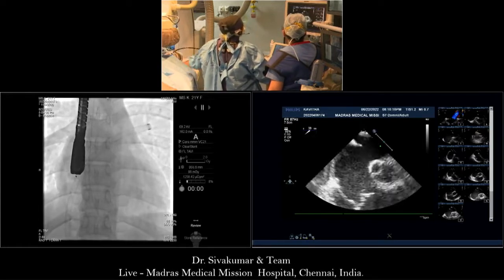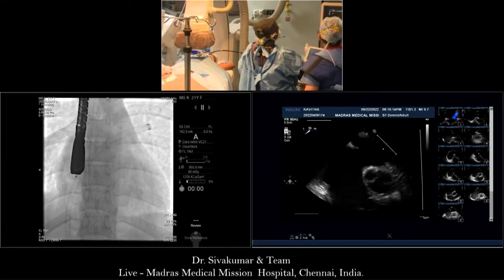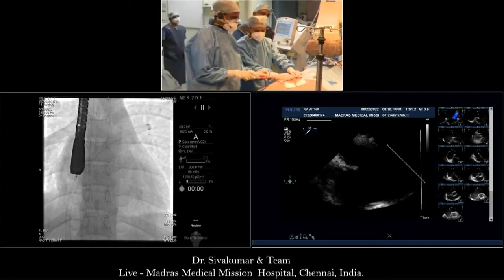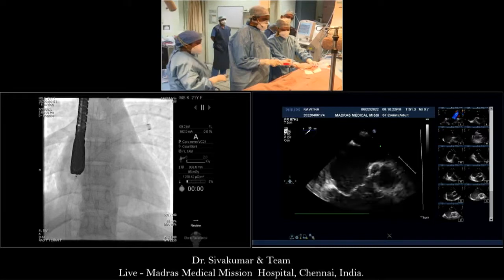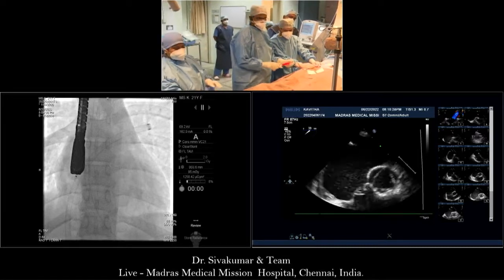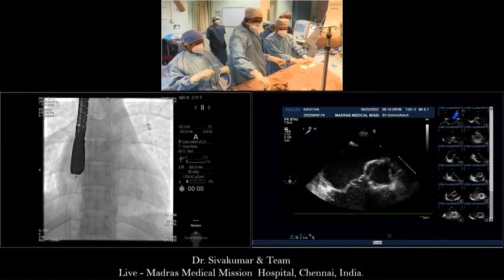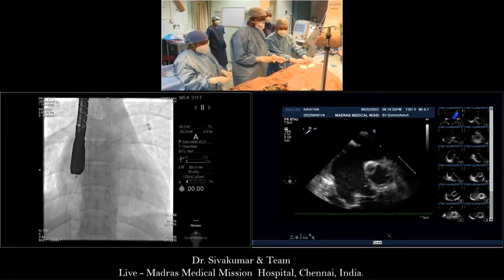Peter, your question to Zahid is, what size device would he use here, without a balloon? Absolutely. Let's give a number. Give me 3 views, we'll measure, and I'll give you the number. So far I've got 31 and about 23, and the last one is missing. This one is about 28. 31 in 4-chamber view was the biggest. And in short axis, if you measure now, please.